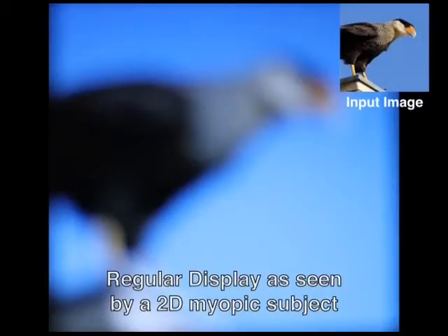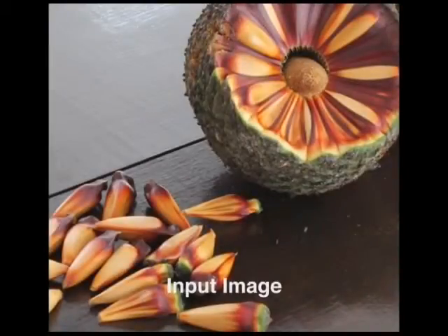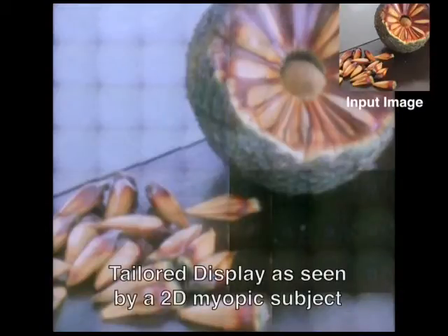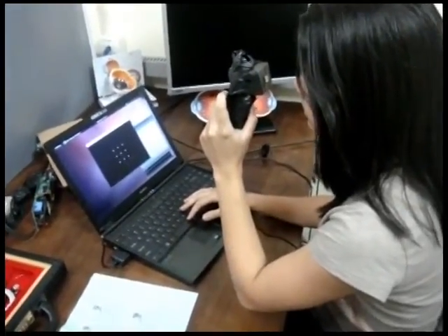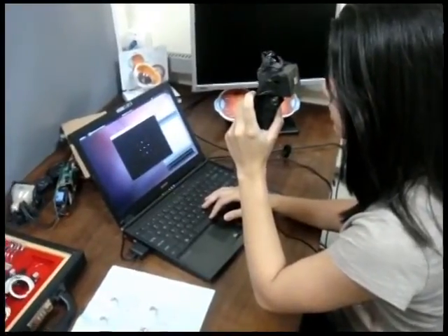We showed that currently available high-resolution displays can create virtual objects at a resolution of about 1 arc-minute, which is the human eye's standard acuity. Our user experiments attest to the display's ability to create corrected versions of virtual objects, and to target specific eye aberrations. According to our testing, users preferred the corrected image up to 98% of the time.